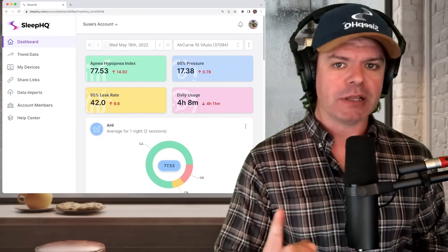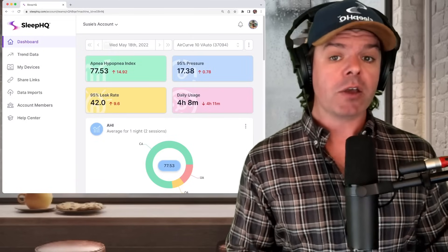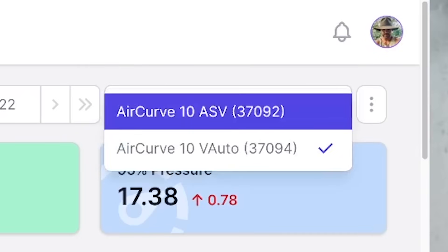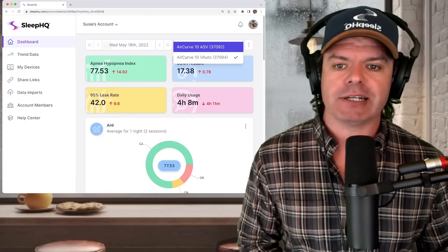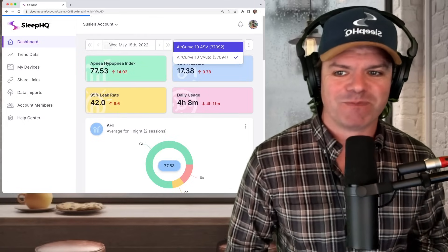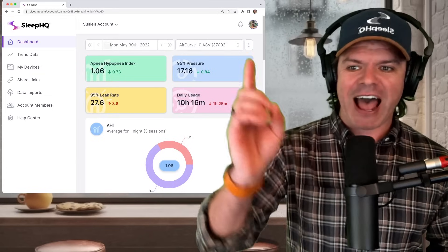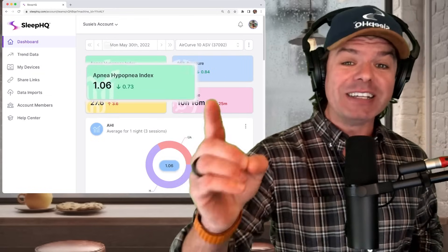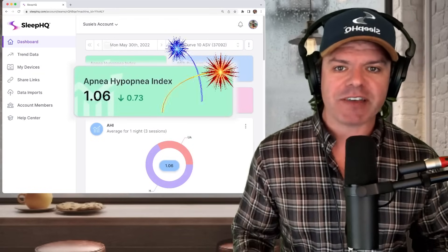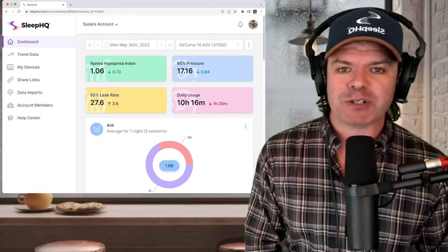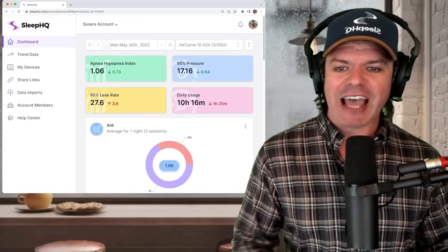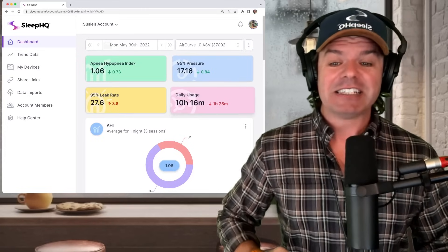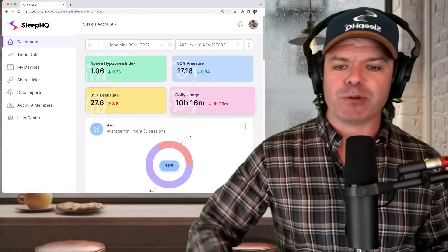But let's see if anything changes when he switches from the AirCurve 10 V Auto to the AirCurve 10 ASV adaptive servo ventilator. Here we go. Holy shit balls. AHI 1.06 down from 77 on the V Auto. Congratulations guys, that is amazing. And check out the daily usage, 10 hours and 16 minutes. That's a damn good sleep.